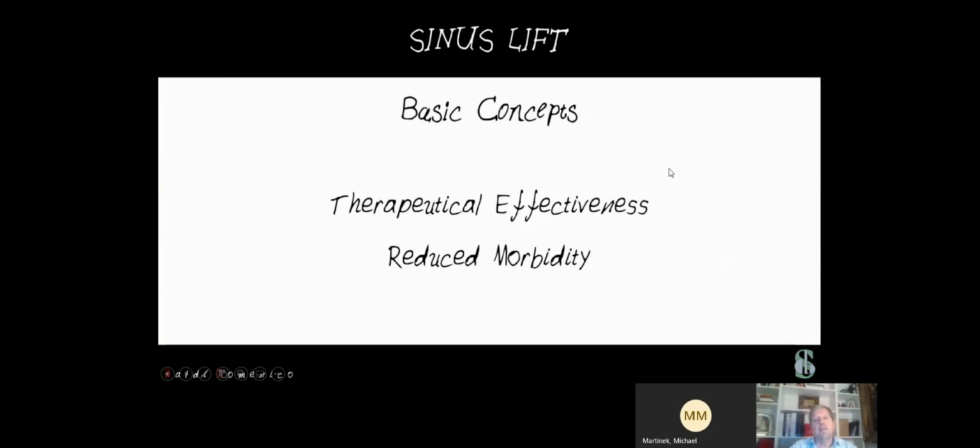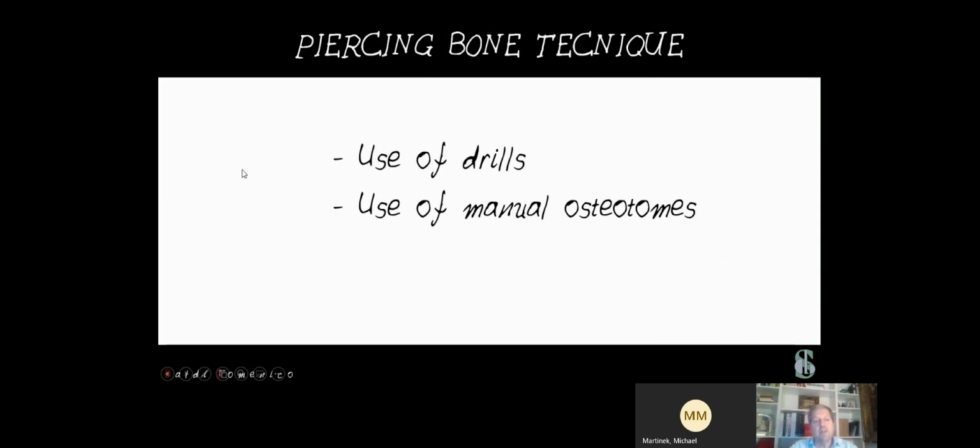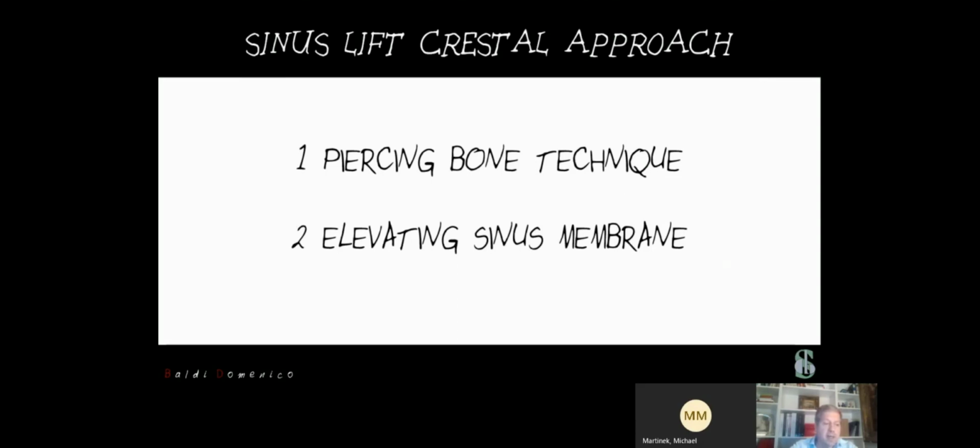We can summarize this concept in a phrase. It means that we want to obtain therapeutic effectiveness, and we want to obtain reduced morbidity. But using the traditional instruments, it's impossible to obtain this, because till now it was possible to use only the drill and the manual osteotome, and it's impossible to obtain this kind of less traumatic approach, because when we make a crestal approach, we do two kinds of surgery at the same time.